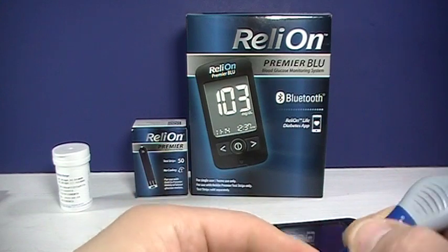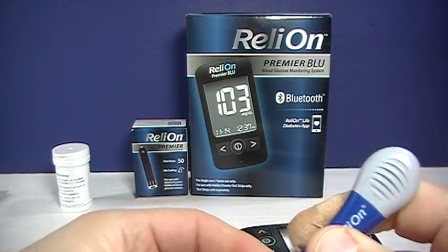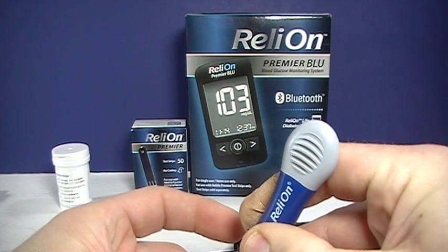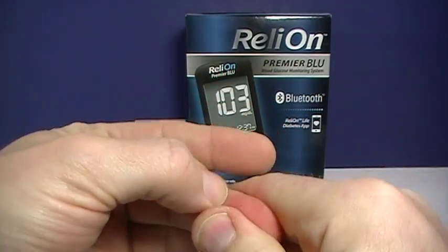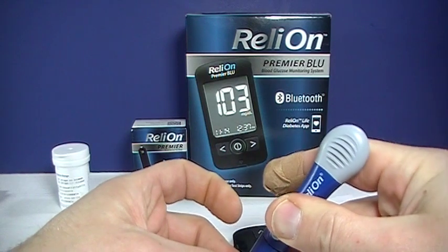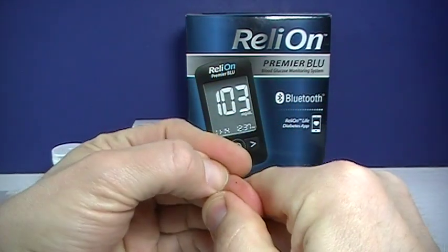So you can go ahead and poke your finger. Of course, you want to wash your hands first. Some references recommend that you wipe away the first drop of blood, and then gently massage your fingers to get another drop of blood. That's not specifically indicated in the manual, but if you're getting irregular readings, you may want to try that, as there could be things on the skin affecting your reading.